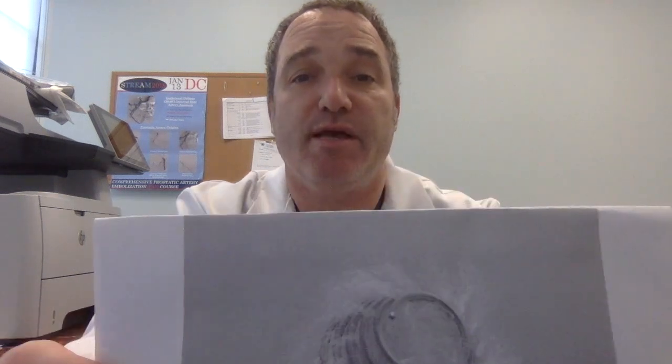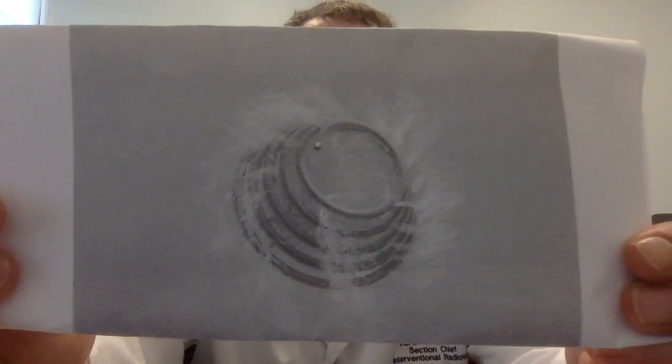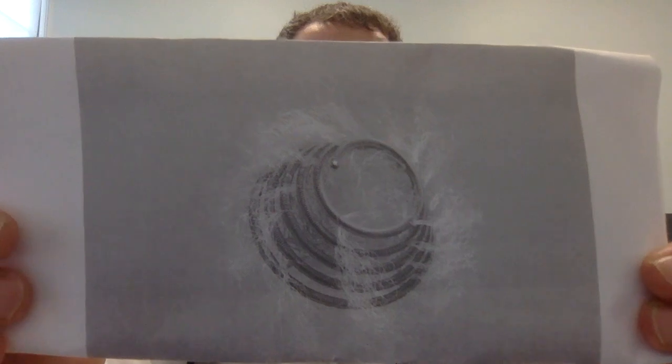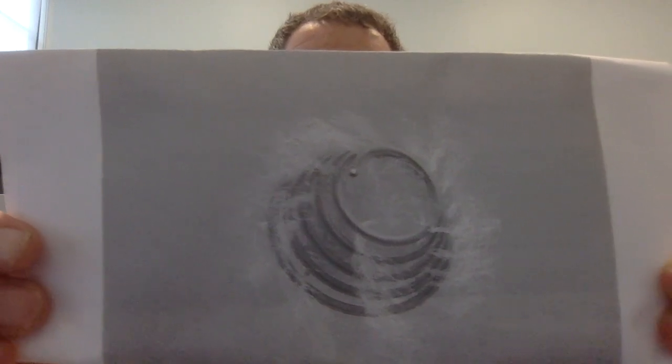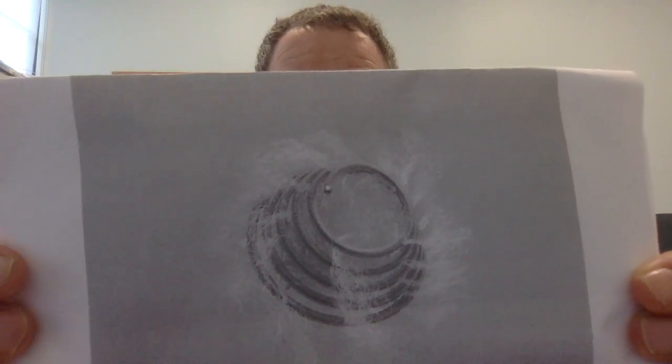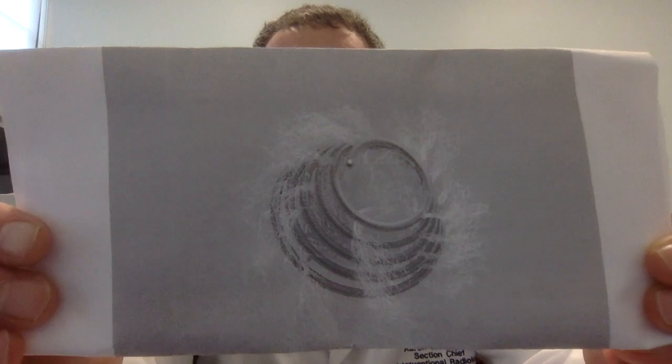The first is a coil, and this is an example of a tornado coil. You can see it has a tornado shape, and it has all these fibers or hairs on it, and they help block the blood flow. They cause clotting when those fibers are in a blood vessel. We use those oftentimes in trauma cases to block off vessels that are bleeding, GI bleeds, etc.